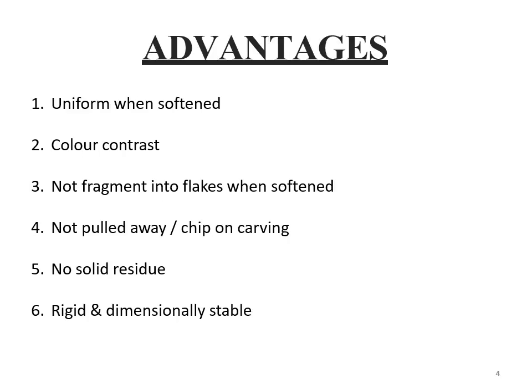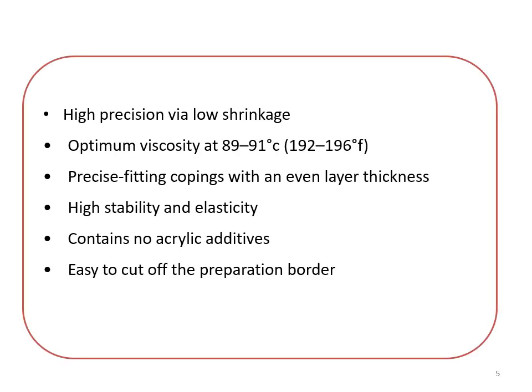Advantages. It is uniform when softened. Color contrast is good. Does not fragment into flakes when softened. Not pulled away or chipped on carving. No solid residue. Rigid and dimensionally stable. It is high precision via low shrinkage.